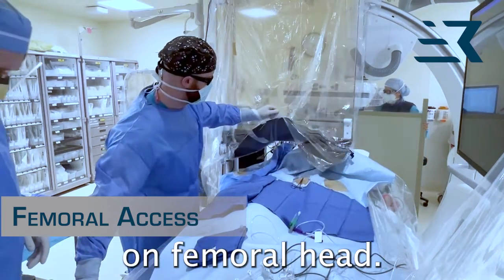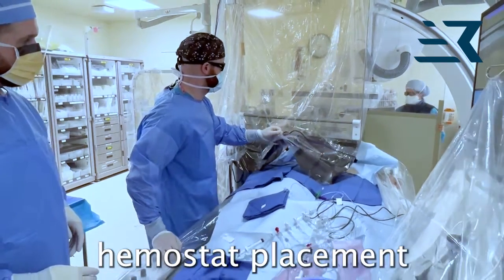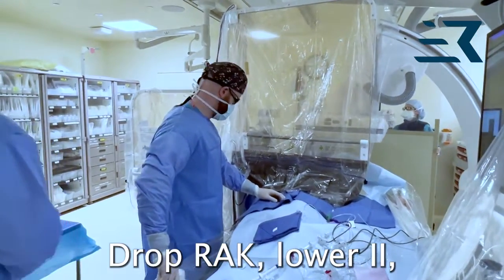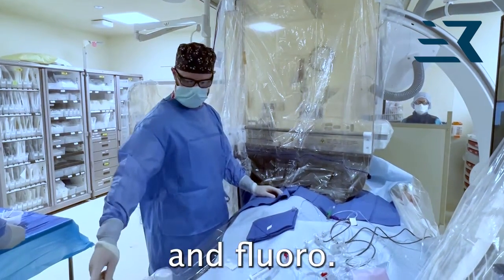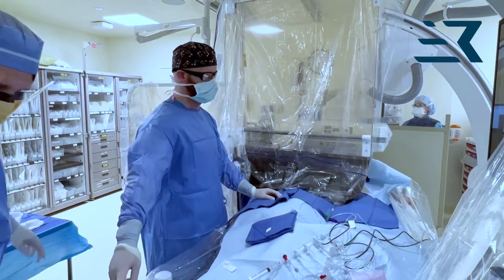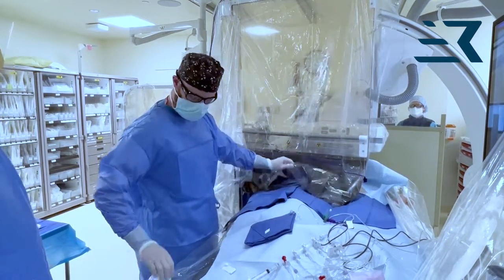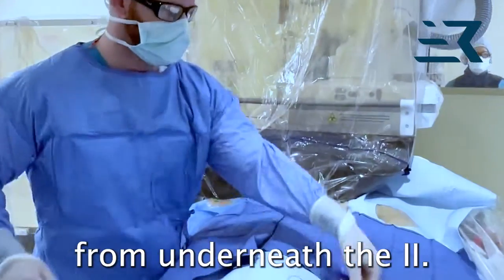Place the hemostat on the femoral head. Lift rack and pan table to visualize hemostat placement under the II. Drop rack, lower II, and raise the table and fluoro. Lift rack and pan patient out from underneath the II.